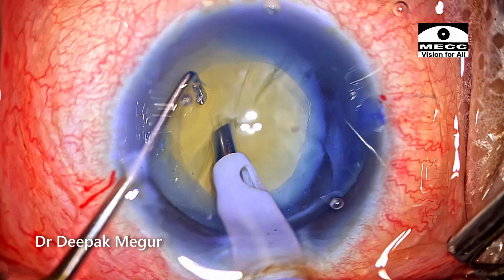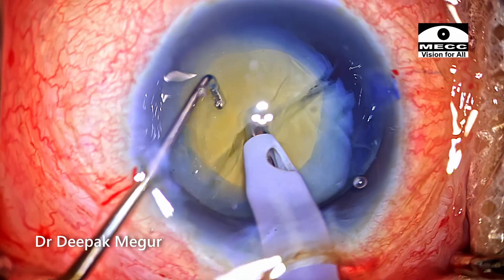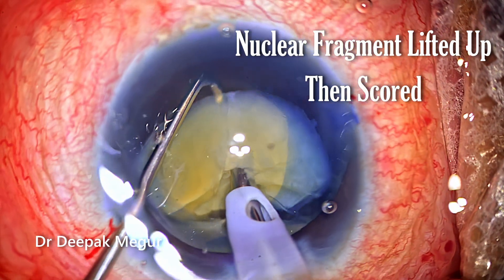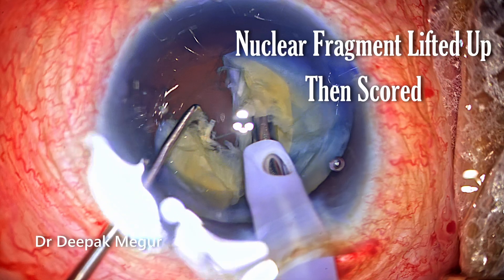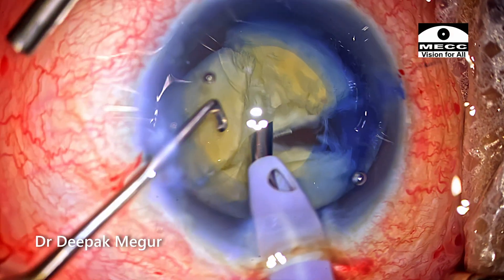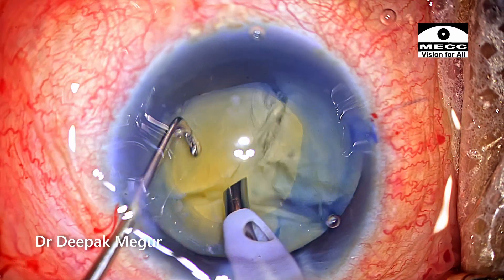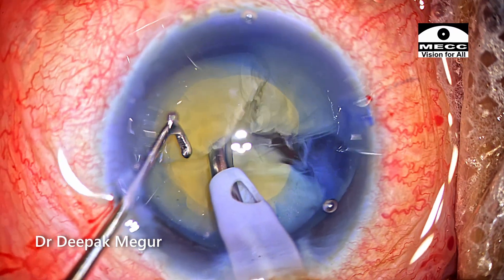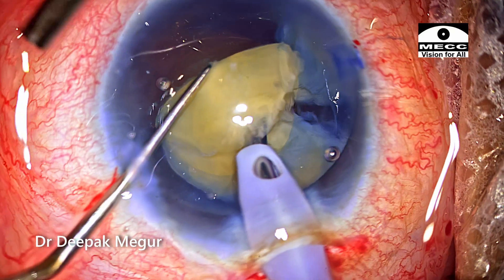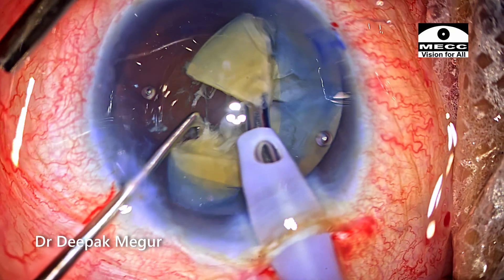The tip is buried inside the second hemi-nucleus, lifted up, and then the horizontal chopper is introduced around the equator and the scoring is done. The eye is extremely deep set so there's a lot of pooling of fluid which is being actively sucked off by my assistant. The chopping is continued until we have four fragments.